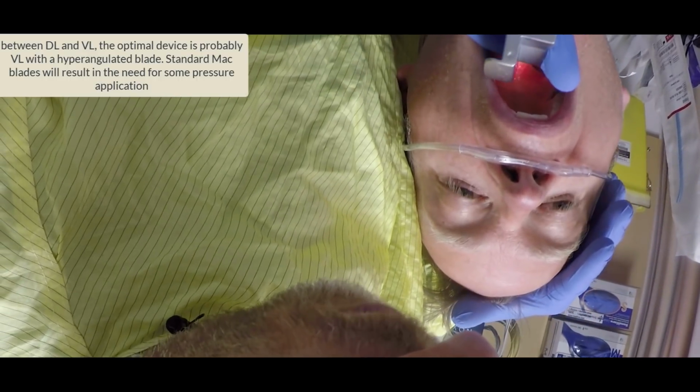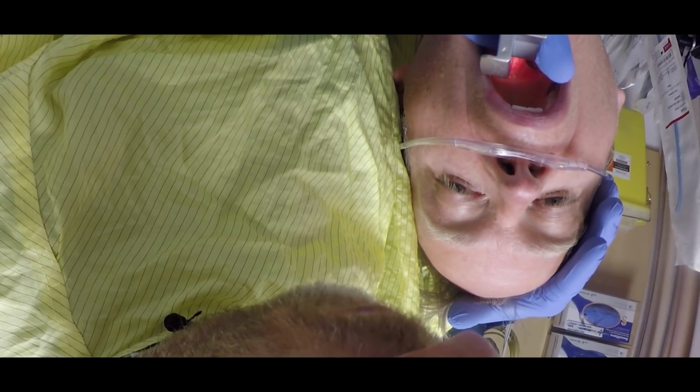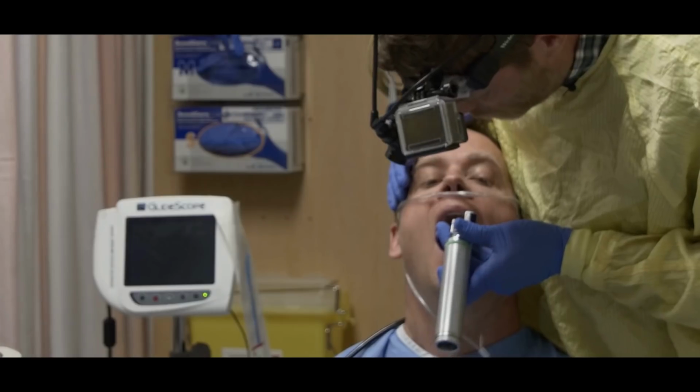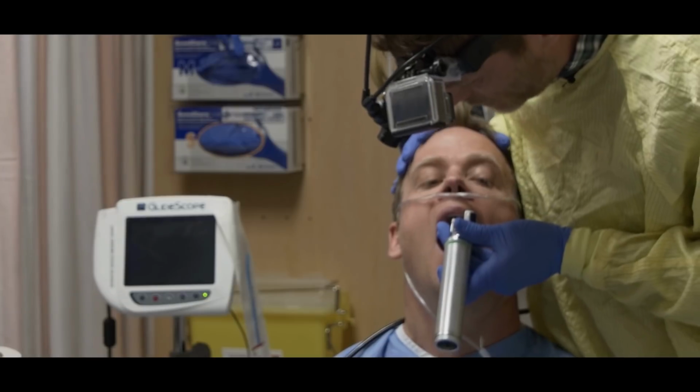So we're seeing posterior wall of the pharynx, and then you just breathe through your mouth, and I'm just incrementally going very slowly. Can I get you to tilt back just a little bit? Marika, can you pull on his right corner of his mouth for me?